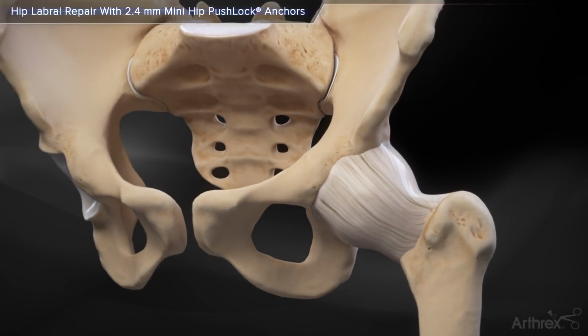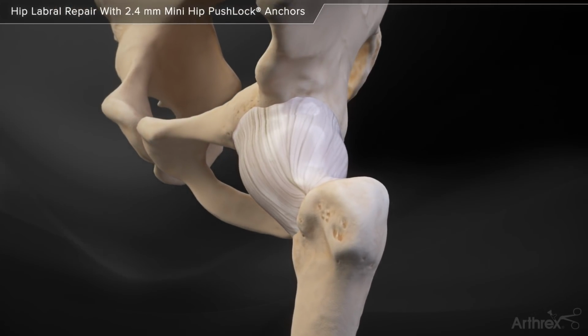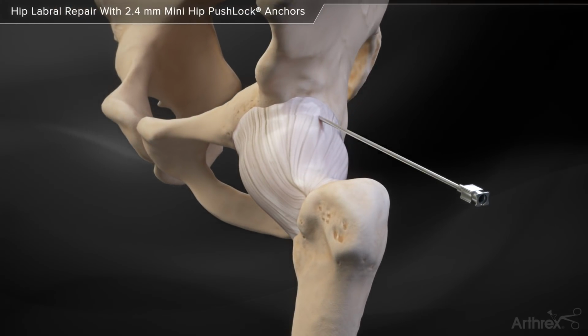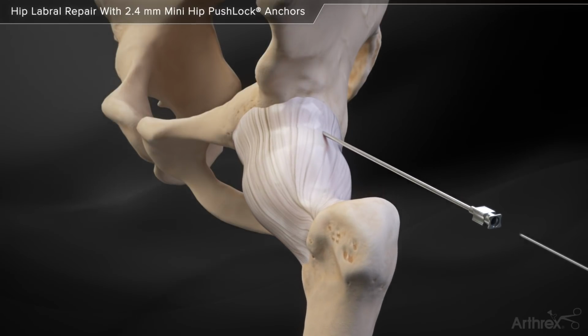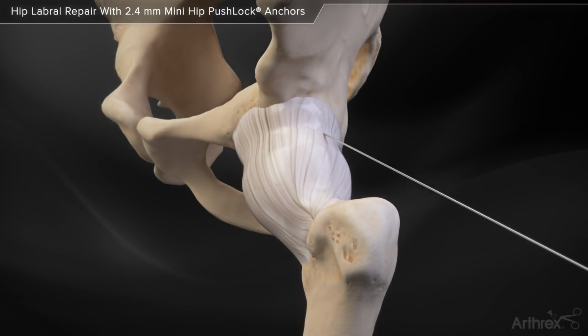Hip labral repair with 2.4 mm mini-hip PushLock anchors. The anterolateral portal is established by inserting a spinal needle through the capsule and removing the inner stylet. The nitinol wire is then placed through the needle and the needle is removed from the joint.